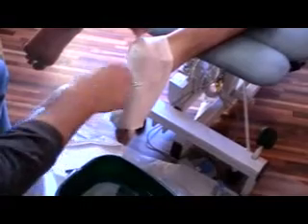Take your second half of your bandage and pull this over as well. Remember, if you pull too much either side, you will make the cast too shallow. Smooth out the bottom to eliminate any air bubbles. Remember, your cast is already starting to set, so it's important to get your second bandage on.